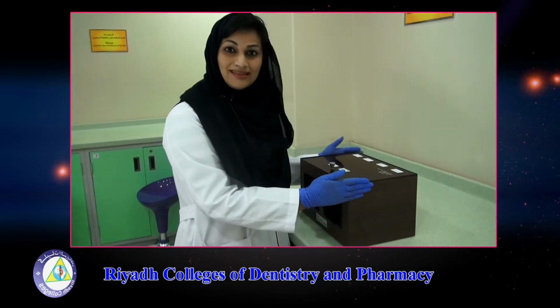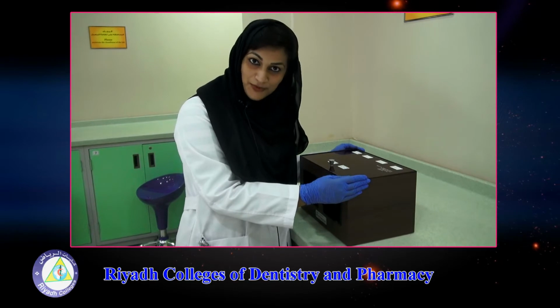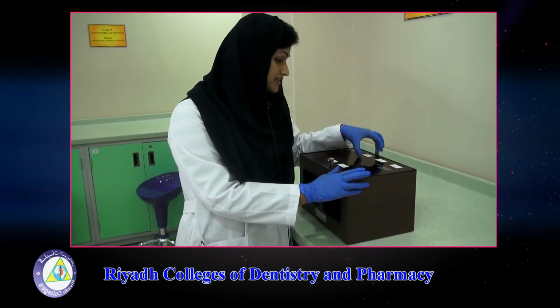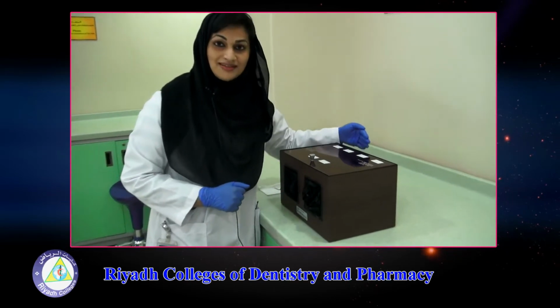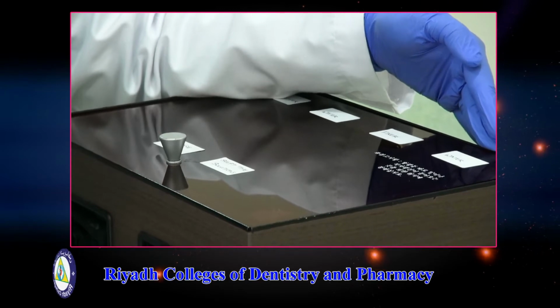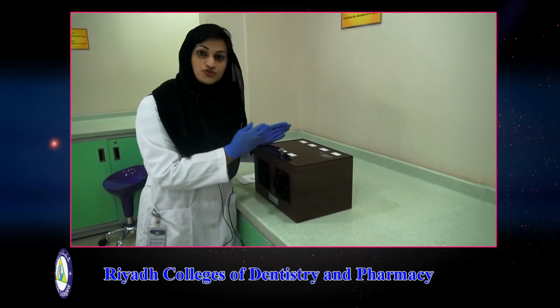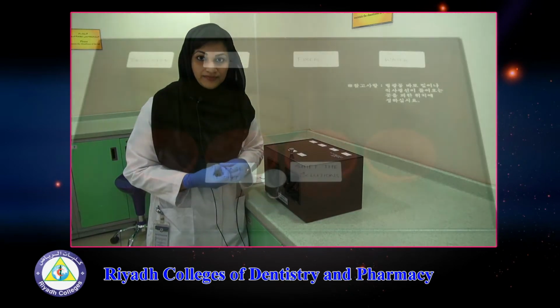Okay, now this is called the daylight processor. So we are going to start with the processing. Now in the daylight processor we have four things to be identified. First is the developer solution, second is the water for rinsing, third is the fixer solution, and fourth is the water for washing. You should always take care that these solutions, the arrangement should not be shifted or misplaced, or else you will get a faulty processed radiograph.